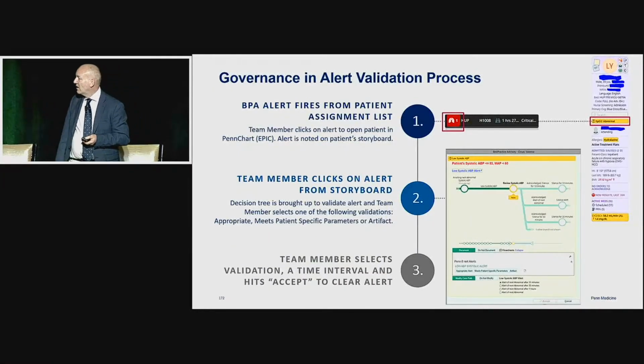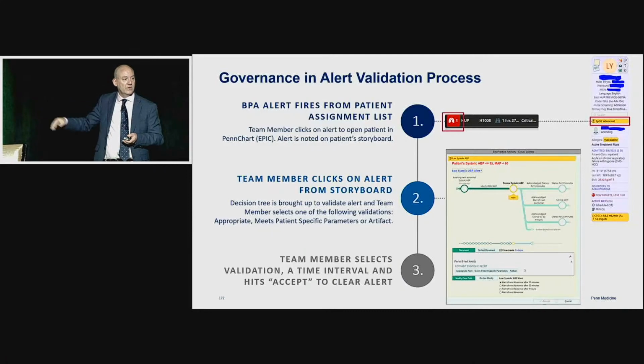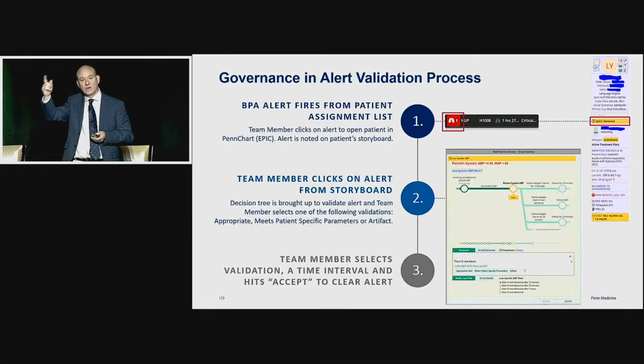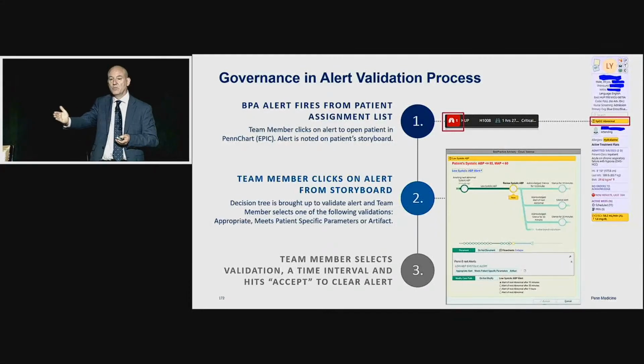This is a bit more of a meaty one. This is hypotension, so we have a much more defined sort of escalation. But can you see we've actually built this into the EMR? So no alarm can actually escape. And we have millions and millions of alarms, BPAs, being worked out every day on our patients, of which we action about 900. So that's 900 actionable alarms where we're actually stepping into a room, getting the bedside provider, and just doing, it might be a minor delta, because the SATs are low and they just need a bit more oxygen, or it might be the fact that they've got a tension pneumothorax that's been undiagnosed and the patient's in distress and no one's recognized it.